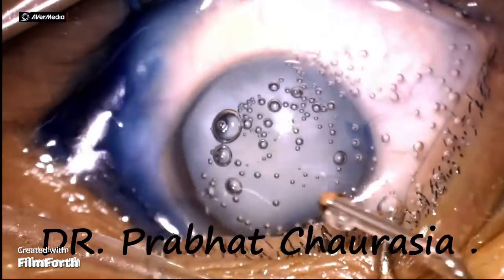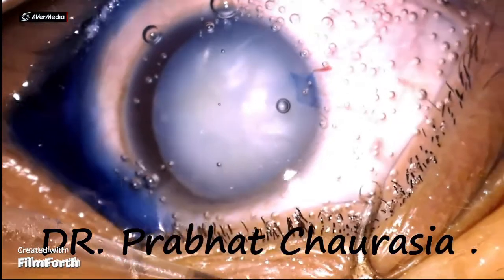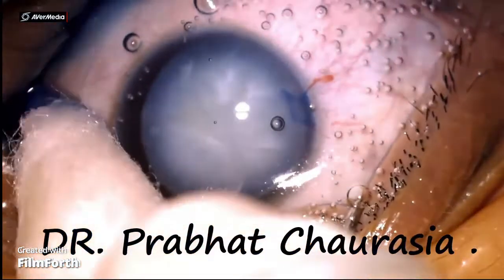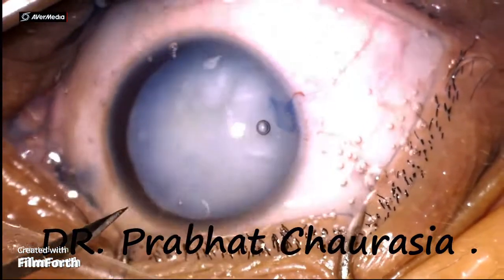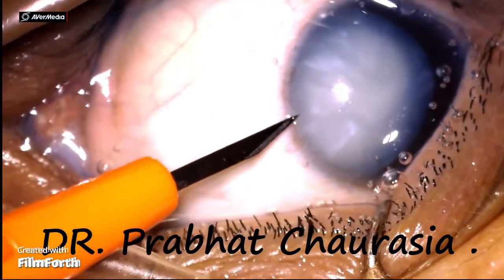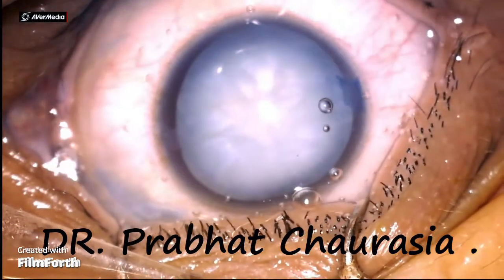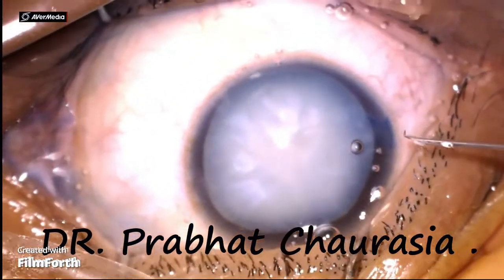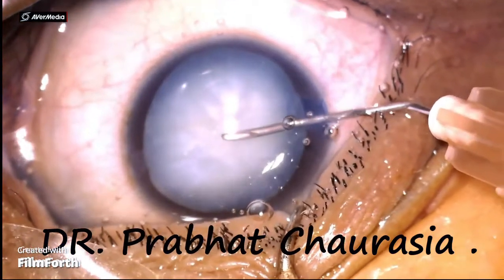After injecting the HPMC, now I am making another side port on the left side. The patient is moving her eye from right to left.